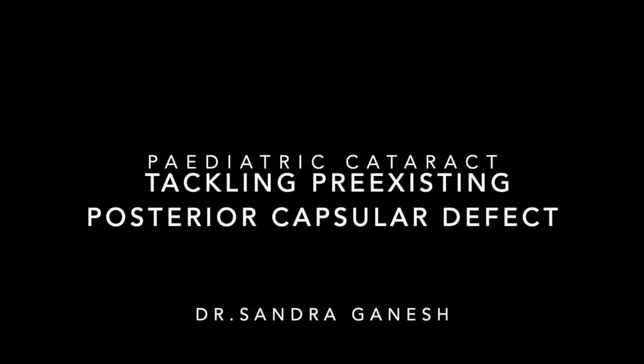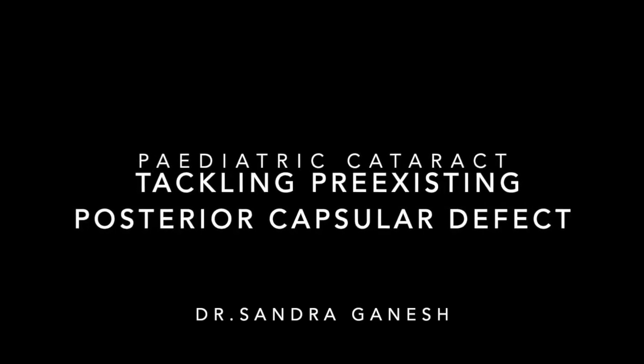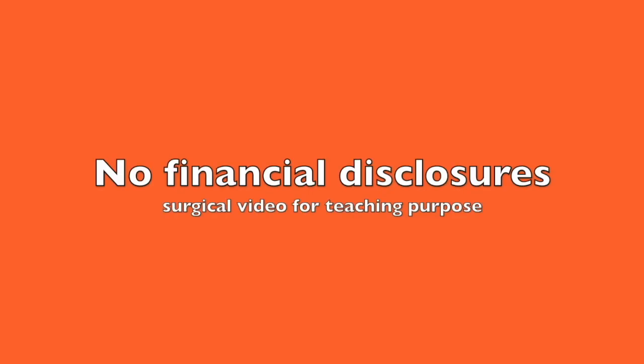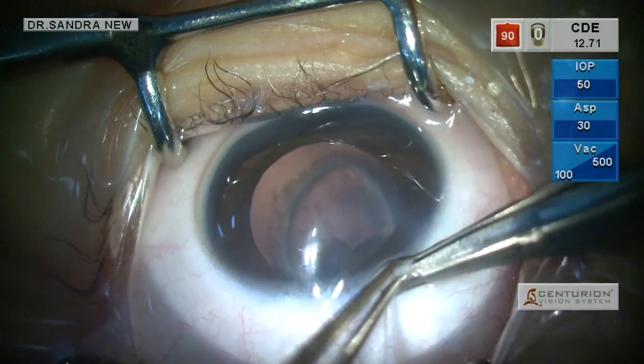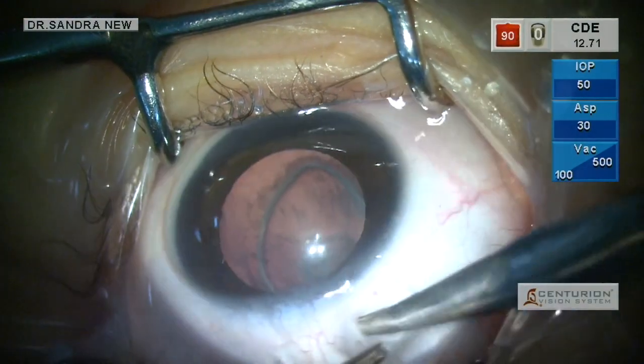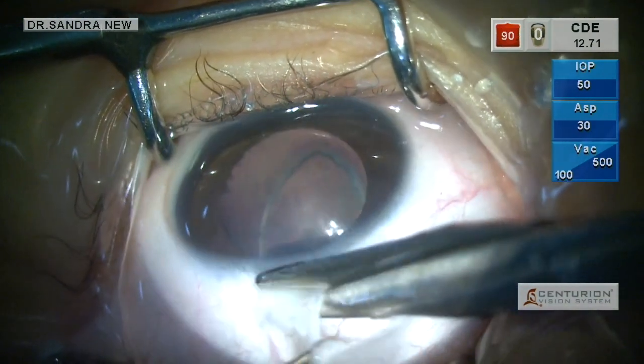Here I am going to explain how to operate on a pediatric cataract with a pre-existing posterior capsular defect. This is the eye of a 2-year-old child. You can see clearly the margins of a pre-existing posterior capsular rent with lenticular changes.